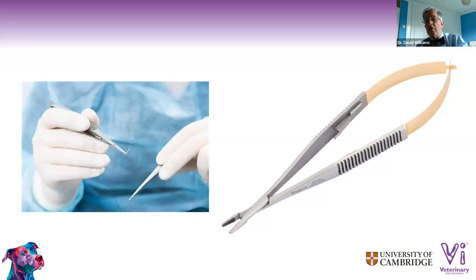And then of course, the needle holders, you can use whatever needle holders you like, but I find that the Castroviejo are really useful. And you can see this one that I've put up there has a little clicker that allows you to hold the needle in place without having to put pressure on the handles. I think that can be a really useful thing when you're being very delicate in where you're putting your needle.